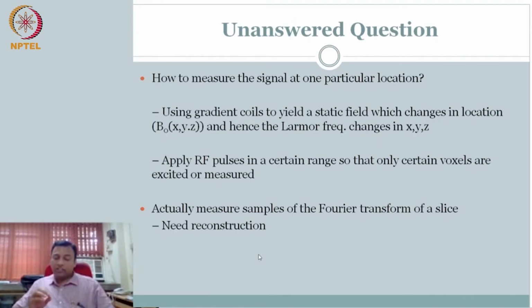The beauty and also the challenge in understanding MRI is that the data you are actually measuring is sampling the frequency spectra. It looks very difficult to understand, but imagine what you are doing. You are changing the Larmor frequency and measuring the signal. What was your signal? Free induction decay. So I can take the power spectra of that, which will have the frequency, the Larmor frequency. So I have the energy, remember Parseval's theorem. I have some signal, some energy for that particular frequency.